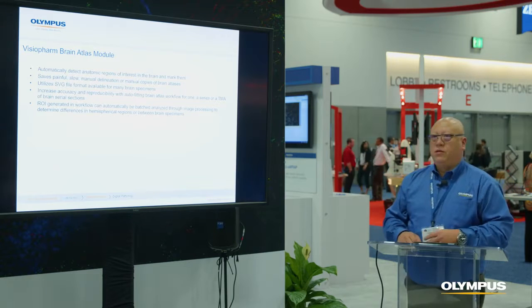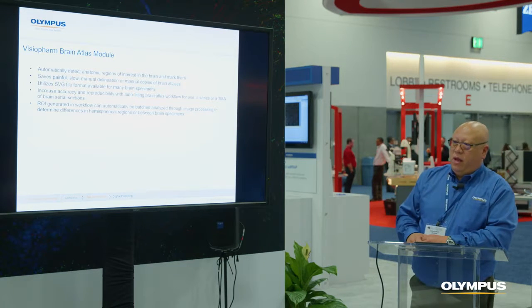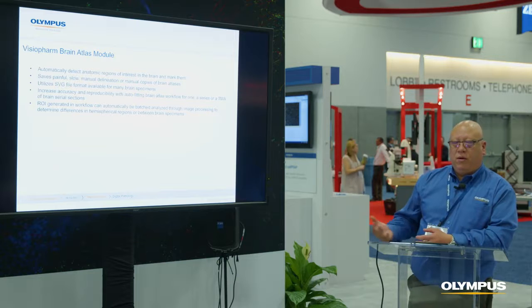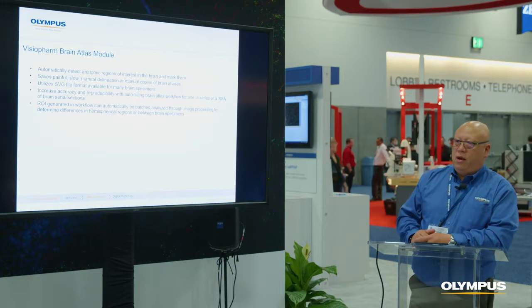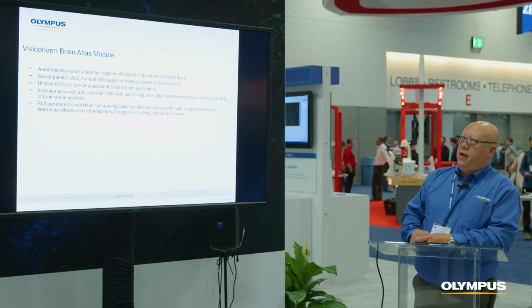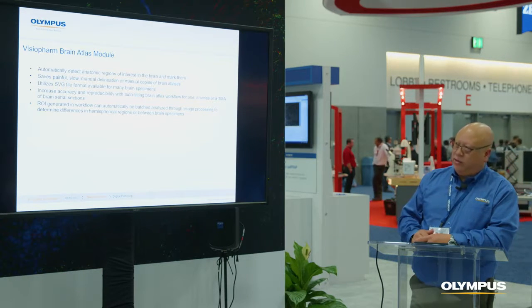But sometimes looking back and forth between a website and a printed book on the atlas can get very tedious. If we can create an application that can utilize, like the Allen Institute, an open source brain atlas, then Visiopharm has taken advantage of that, and they're able to take that Allen Institute Brain Atlas and automatically detect regions of interest.